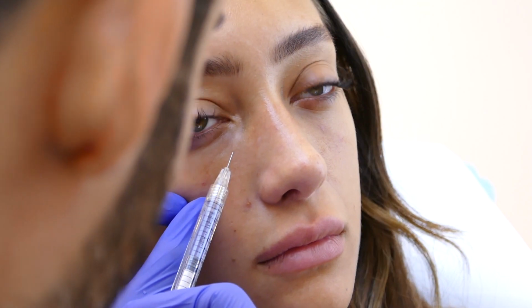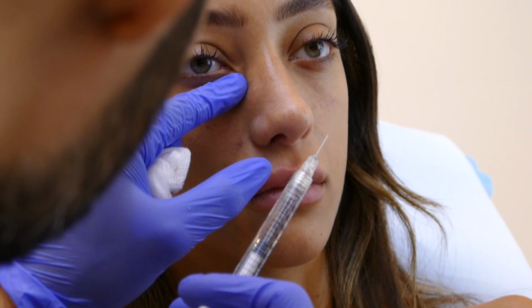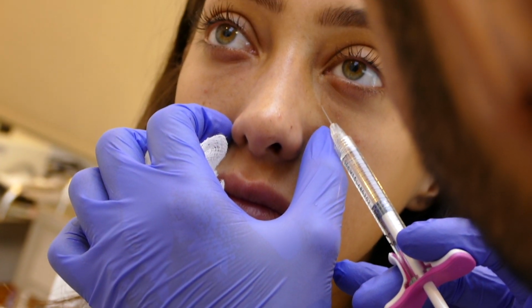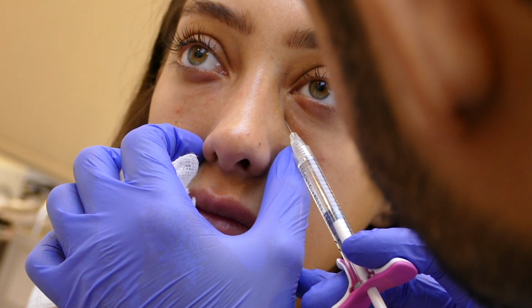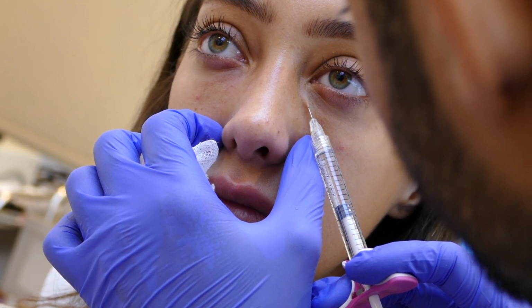The medial most part of the tear trough I prefer to inject with a needle, so that gives a precise placement, and it could be at multiple levels. It could be slightly deep under the muscle and a little bit underneath the subcutaneous tissue.